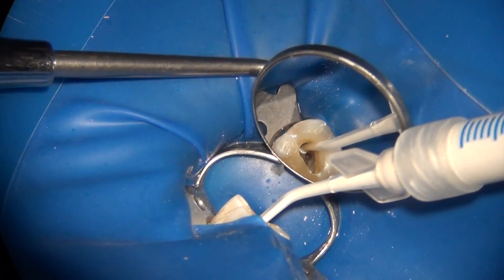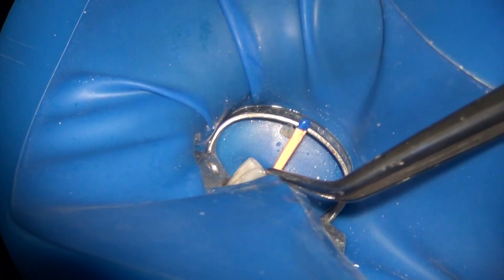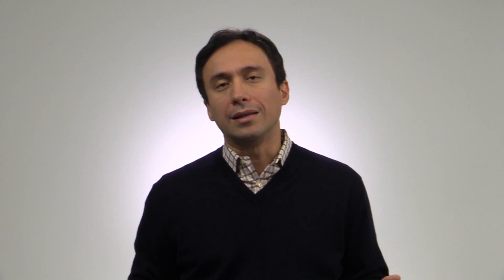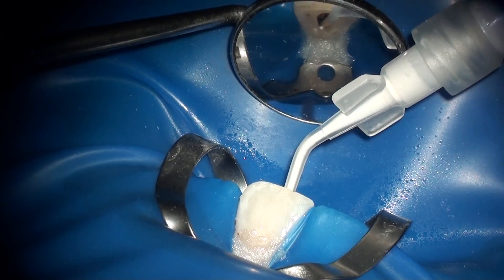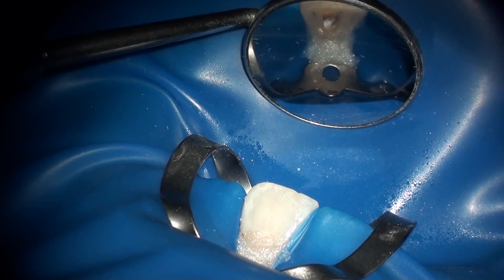The original obturation technique that I developed for the bioceramic sealer dates back about 5 years and you may have seen it in my previous videos. It is now considered the advanced hydraulic condensation technique. In this technique, the sealer is injected into the coronal two-thirds of the root canal directly from the BC sealer syringe, and then a bioceramic coated cone is cemented into place to full length. This technique works great if you have a microscope or high magnification, so you can see how much sealer is being injected into the root canal.